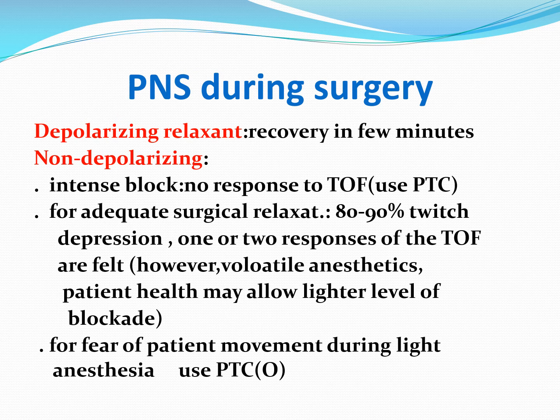During surgery, recovery from depolarizing relaxant usually occurs in a few minutes. For non-depolarizing intense block, there is no response to train of four, and we make sure of this by using post-tetanic count, by producing a tetanus for 5 seconds, followed 3 seconds later by a single twitch stimulus, and we see the number of twitches. Of course, the presence of zero indicates intense block.